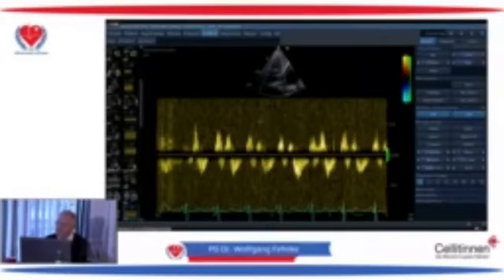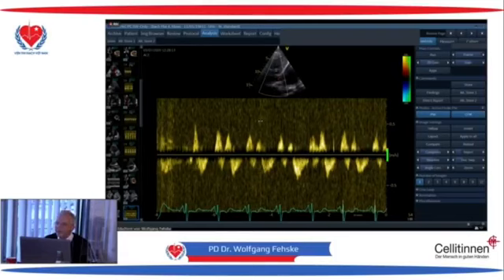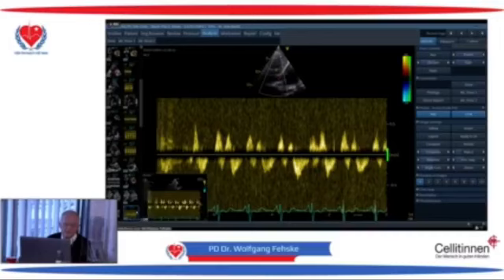So coming back to what was shown some minutes ago, the reason for the tricuspid regurgitation, functional tricuspid regurgitation, is a very rare case of a severe RCA infarction of the free wall of the right ventricle. We have a slightly compensated, under resting conditions, severe tricuspid regurgitation with a reduced forward flow. The question is, what can we do with this kind of patient?